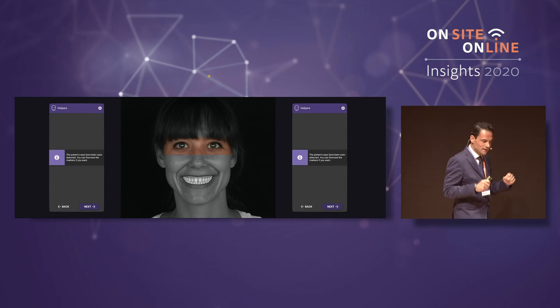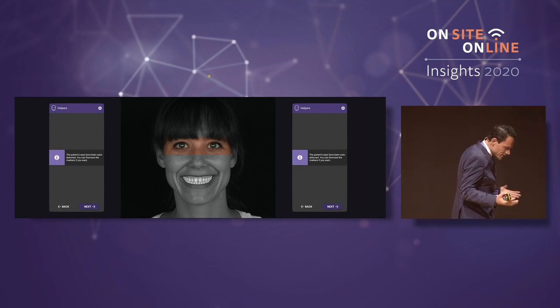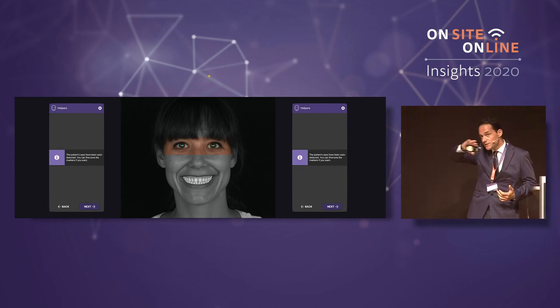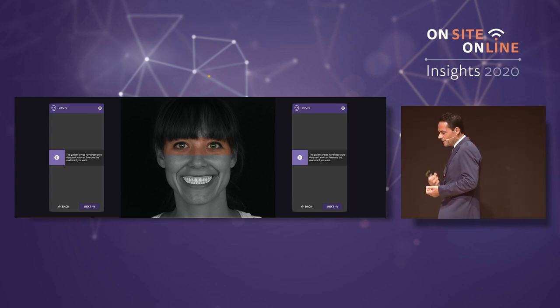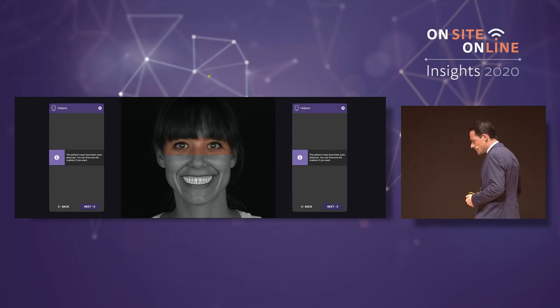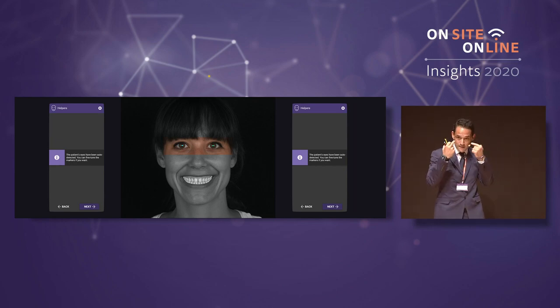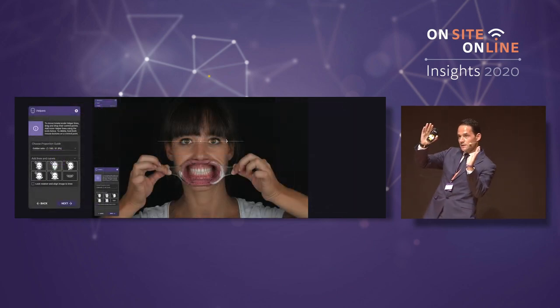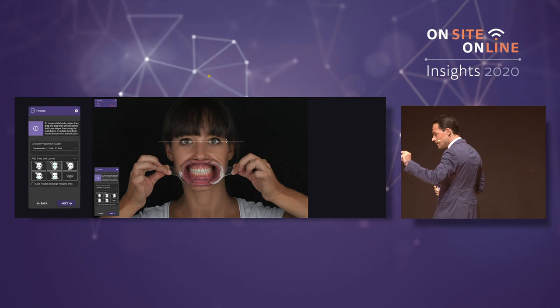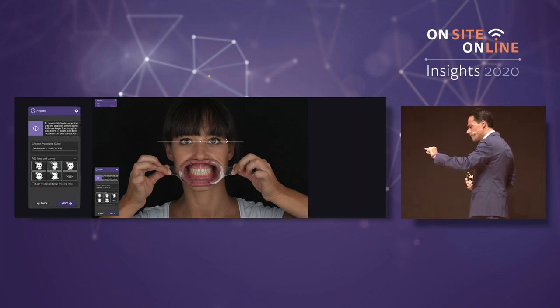The bipupillar plane. Sometimes it is not the bipupillar. Sometimes it is the bicommissural, an arbitrary one, the real horizon, or sometimes we don't know it. Try to look for some information about natural head position, and it will help you to decide which plane is correct for this kind of planification. The software detects the pupils, and you can move these points if you consider it necessary. Then you rotate the image, and an automatic custom view is generated.